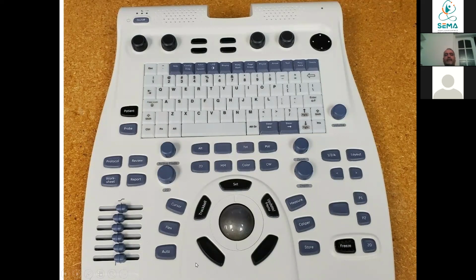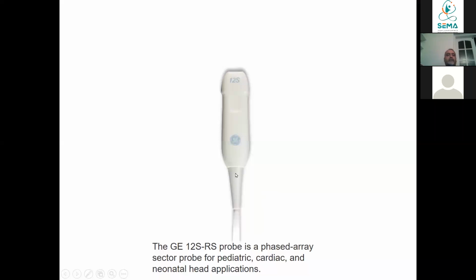Others, I think you will learn later when you are interested. So I don't want to waste your time unnecessarily. Okay, this is a probe. Usually on the probe there is a marker, which you will put in a certain place to have the optimal images.